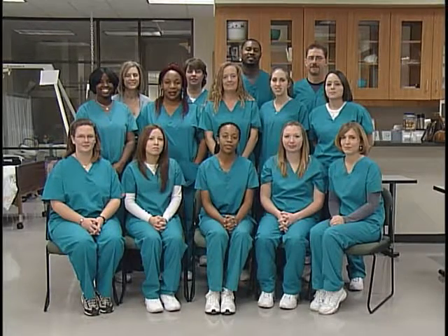Welcome. This is a class of 2009 Occupational Therapy Assistance. Today we will be demonstrating the proper use of goniometry.